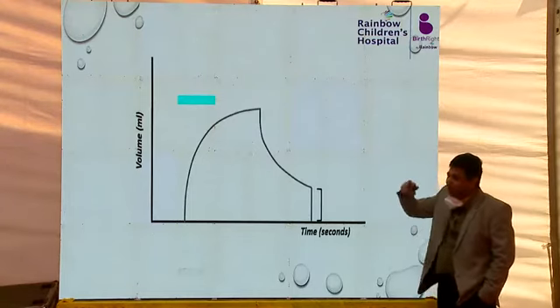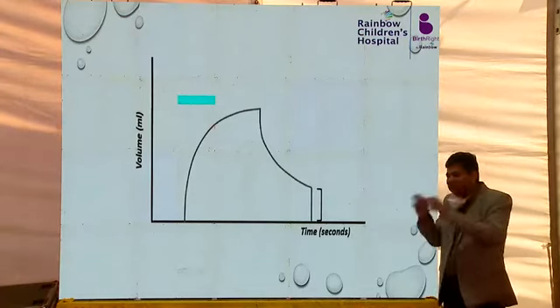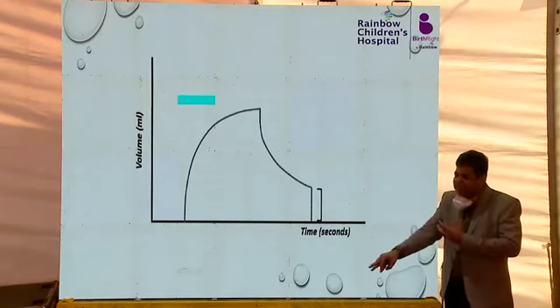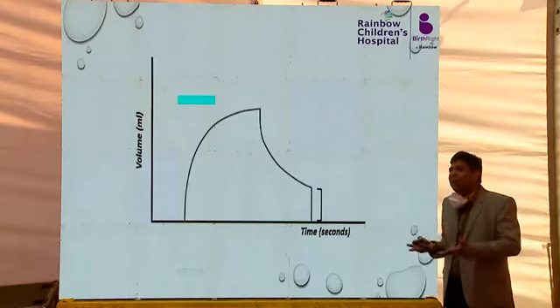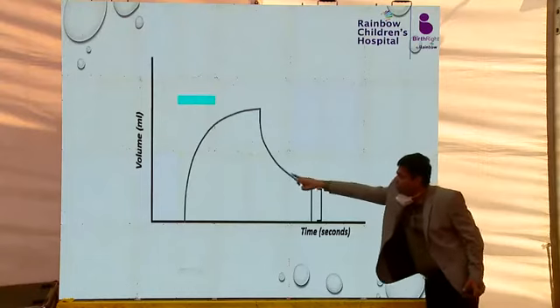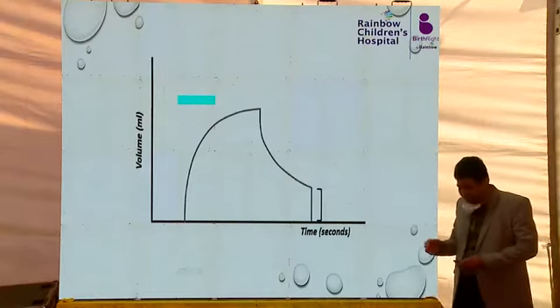When there is a leak, the flow sensor is basically not calculated. Try to understand. Whatever is coming out is lesser than what was going inside. So where has the remaining gone? It has gone into the peritubal leak. If the leak increases, suppose this is 20%, if the leak is 30-40%, this line will come here only. If the leak is 100%, then it is not coming back. We will show you.